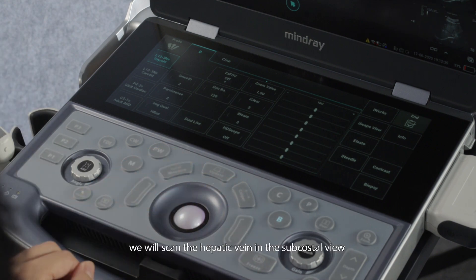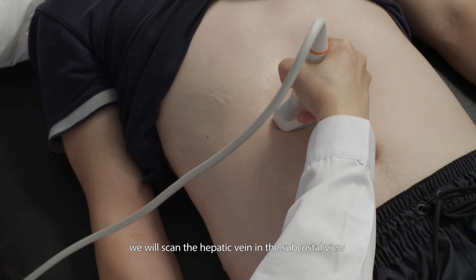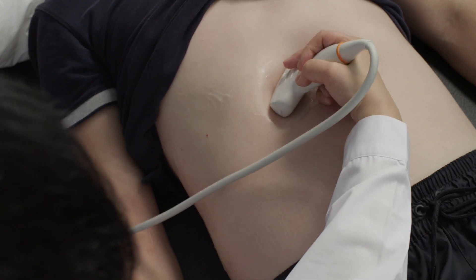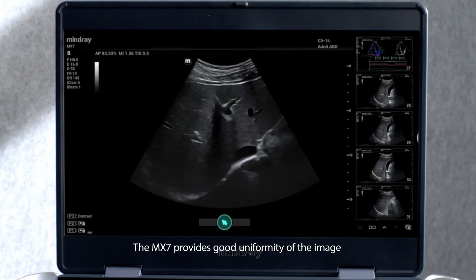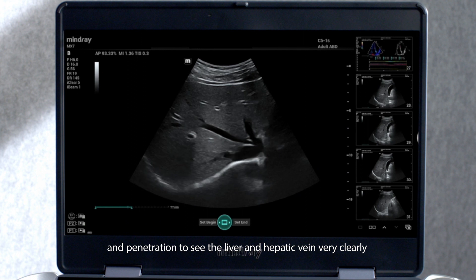Secondly, we will scan the hepatic vein in the subcostal view. The MX-7 provides good uniformity of the image and penetration to see the liver and hepatic vein very clearly.